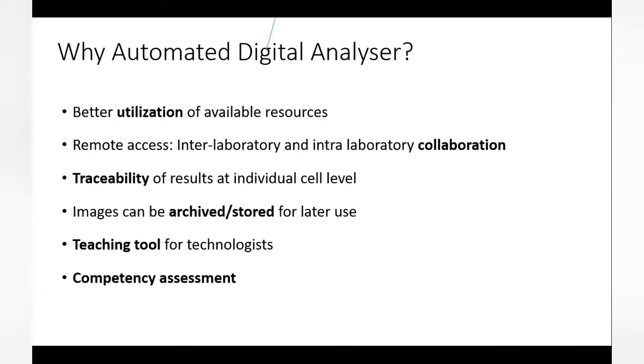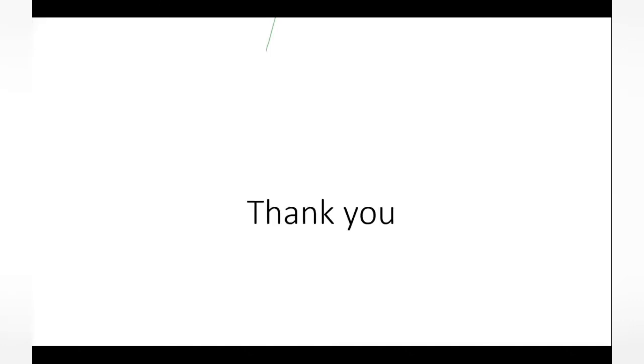The images can be archived and stored for later use. It can be used as a teaching tool for technologists or even for pathologists, as well as for competency assessment.